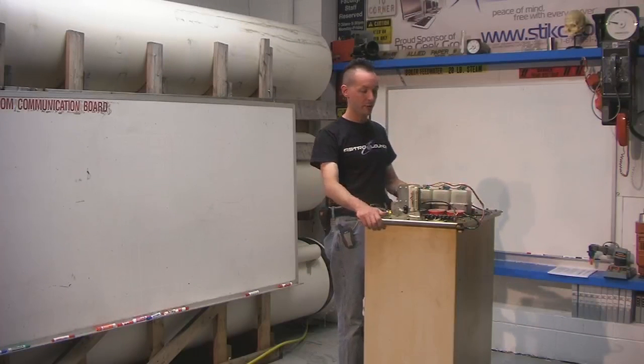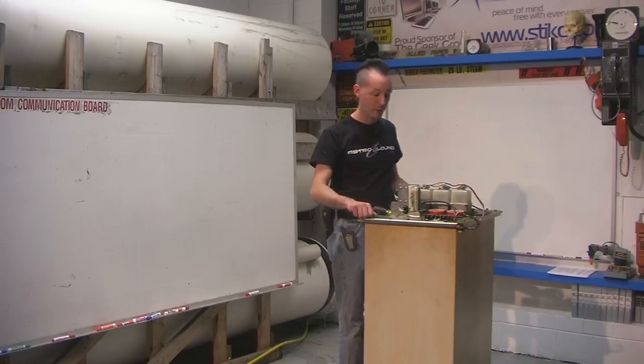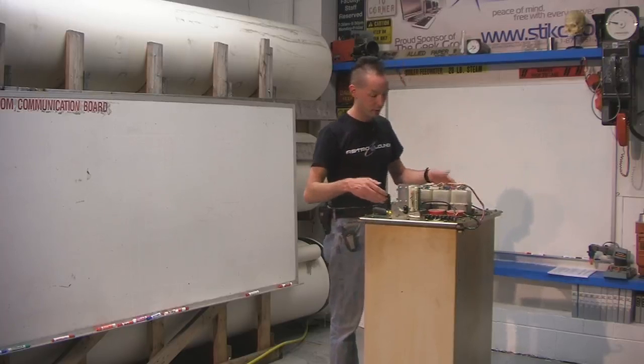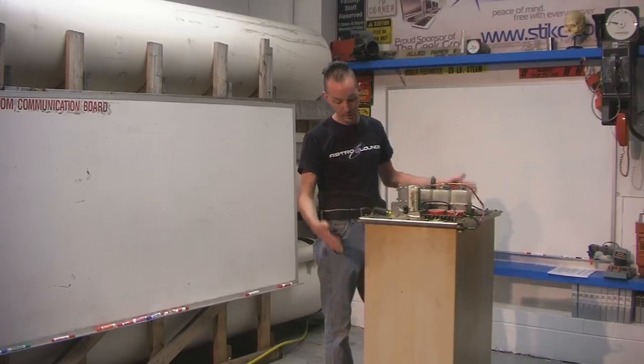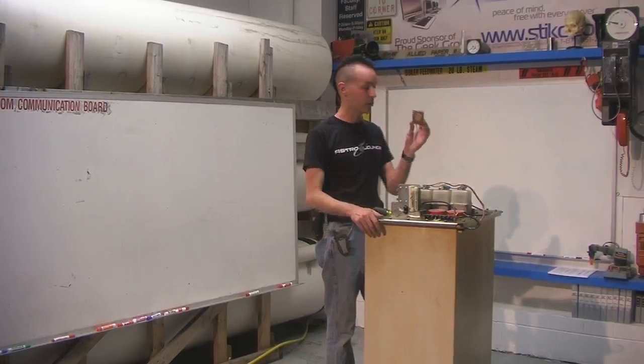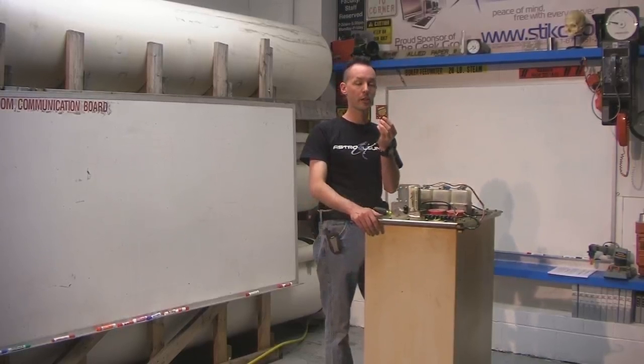we have a big high voltage box. We have no idea what this is. I suspect it's an x-ray transformer, but I don't know where it came from. It came in as an anonymous donation. It's obviously got big high voltage federal connectors on the top. It's a big heavy tank, which is obviously full of oil, and it has this really nifty thing on top. I have no idea what this is, but I'll let Mikey zoom in on it.